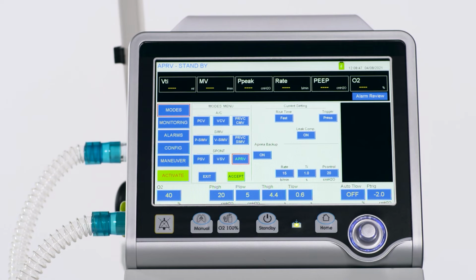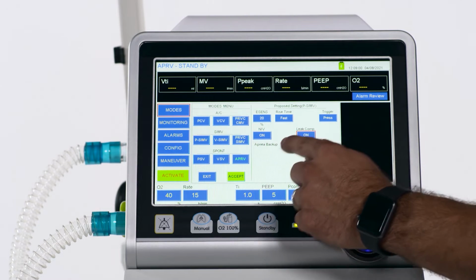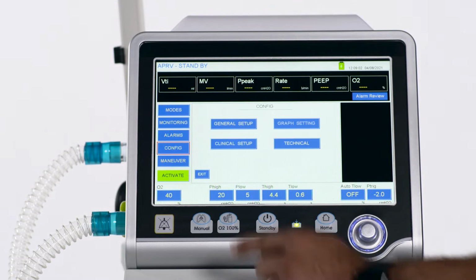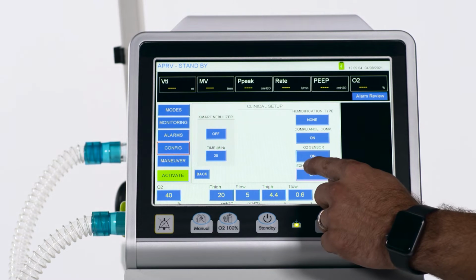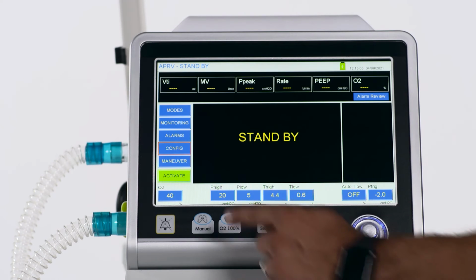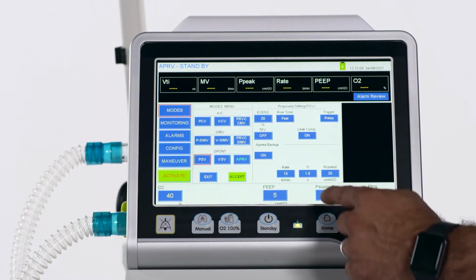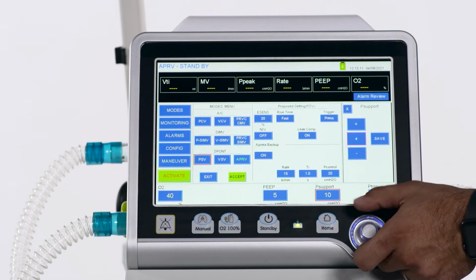For non-invasive ventilation, the system is able to operate with PSV and PSIMV modes. You need to activate leak compensation and the exhalation flow sensor. Please consider that the face mask must be non-vented type. Also, for using CPAP, you can select PSV mode with the difference that P support must be set to 0.